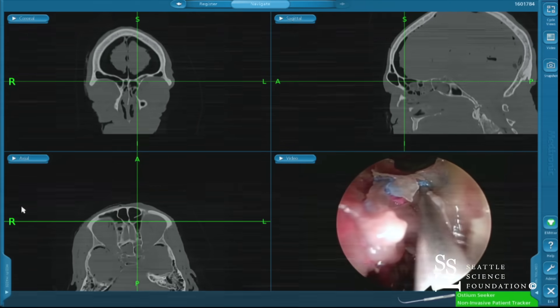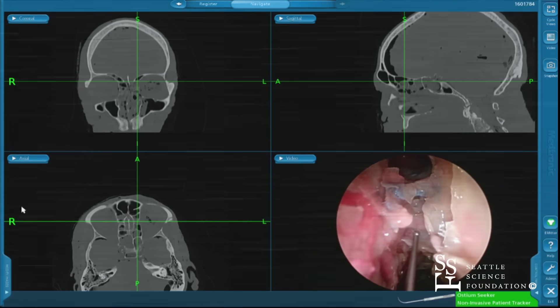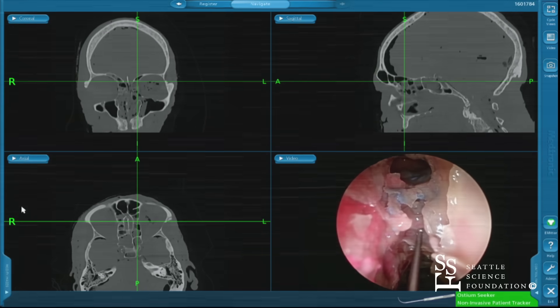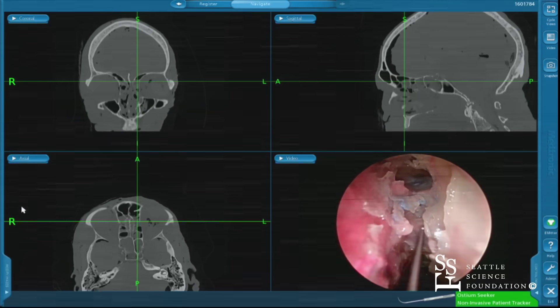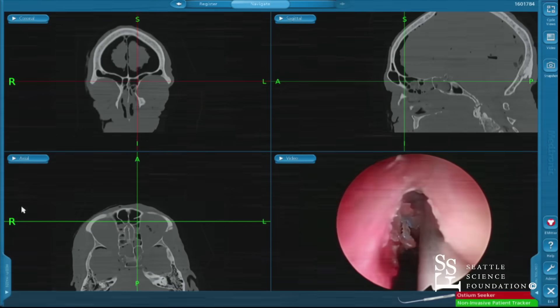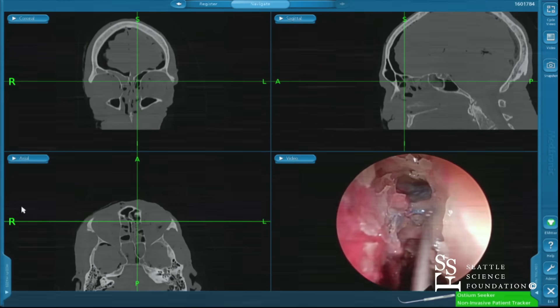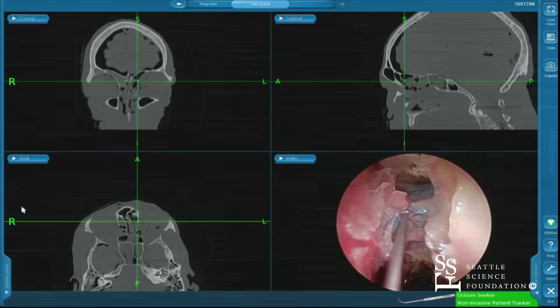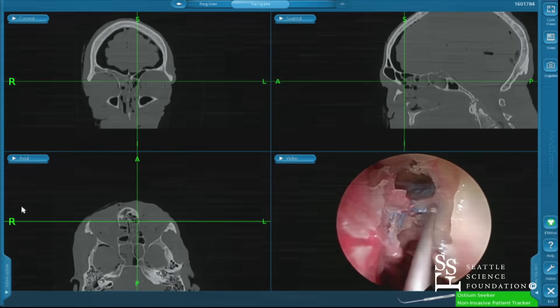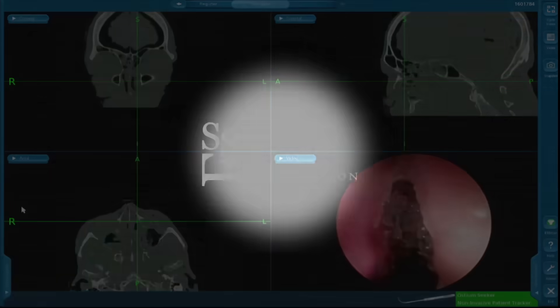Just like Rick pointed out, here's some venous vascularity beyond. Right here is your anterior ethmoid artery coming across. It's always going to be like one step back from your actual true frontal sinus — it's never going to be right there at the posterior table. Some people see this little vessel in the skull base and think that's their anterior ethmoid artery, but that's not it. It's always going to be one step back over here.